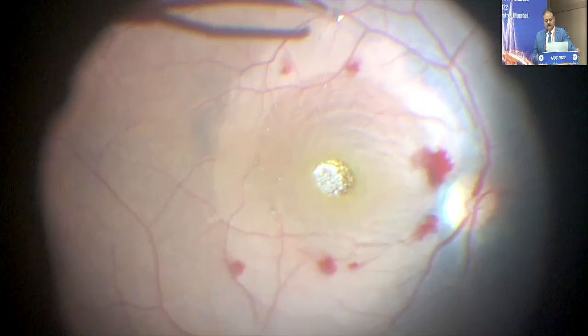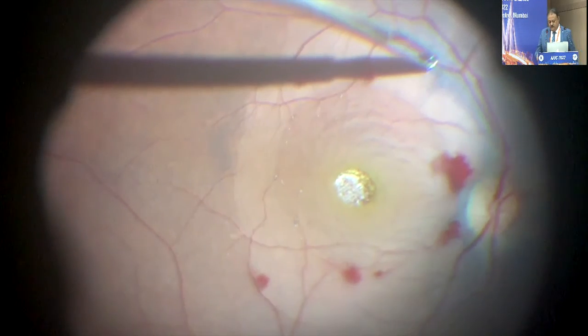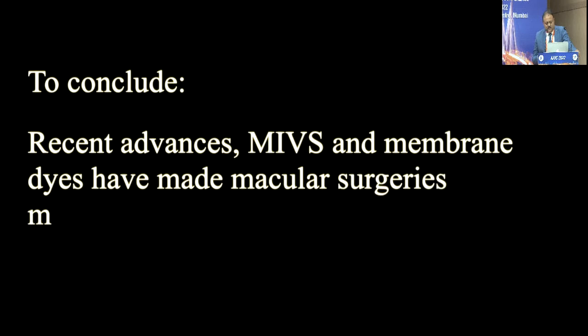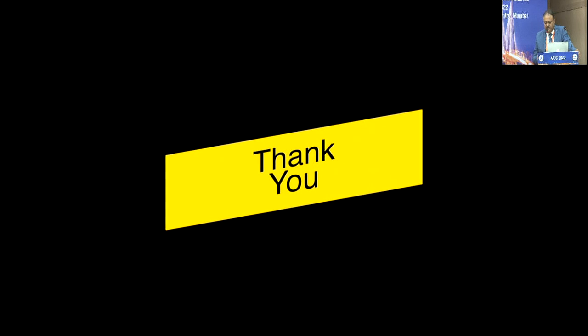Now we have done almost arcade to arcade peeling. And obviously the fluid air exchange in this kind of case is very important, with gas tamponade and instructing the patient to maintain prone position. A little bit of massaging also helps. So to conclude, recent advances, MIVS and membrane dyeing have made macular surgeries more predictable, and obviously with improved outcome. Thank you.